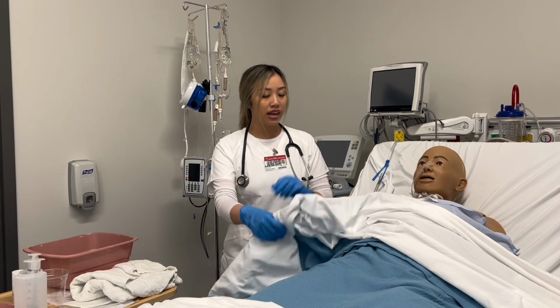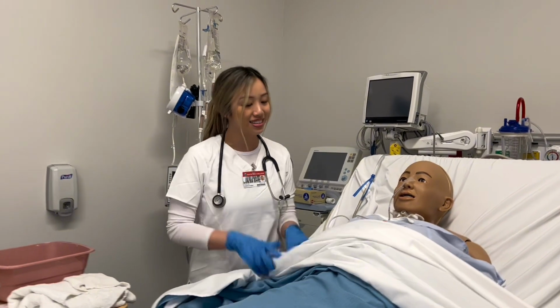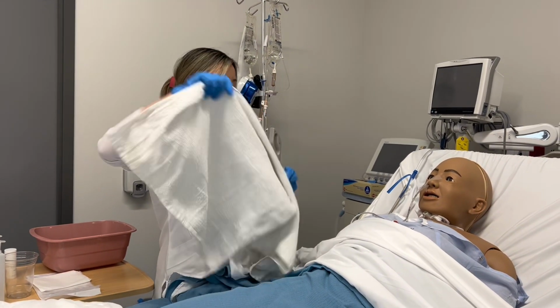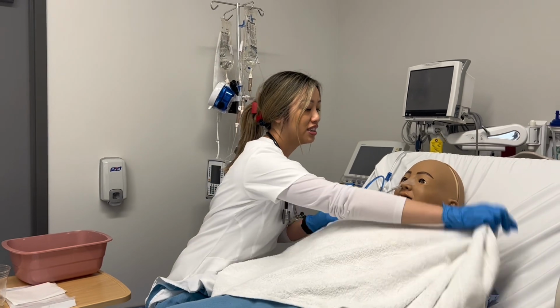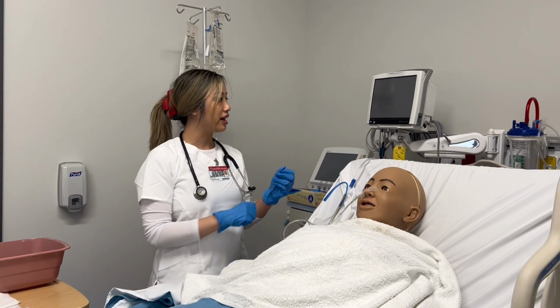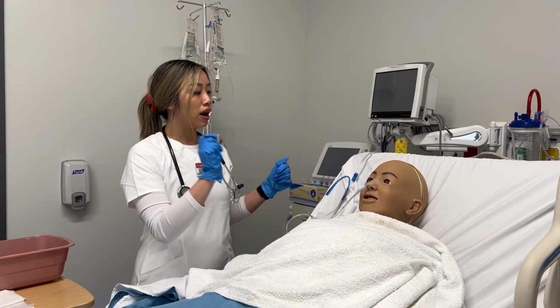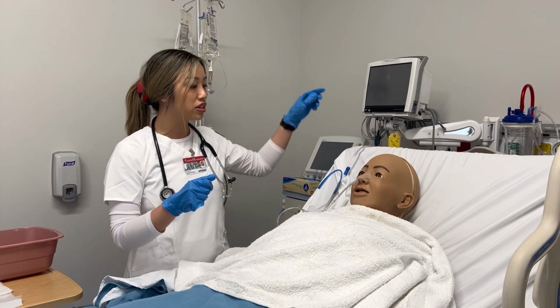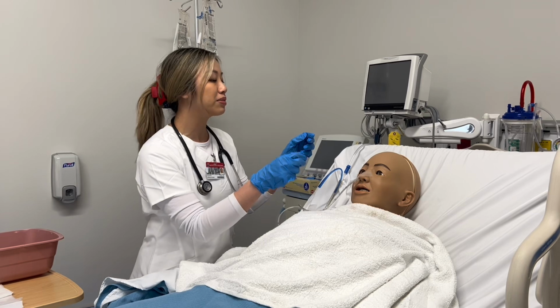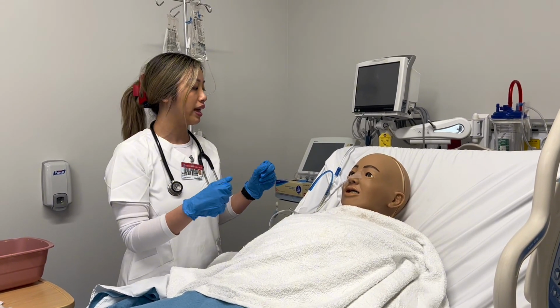So let me just identify my patient again. Mr. Smith, March 6, 1966. I'm going to go ahead and drape you. So I'm going to go ahead and drape my patient. Okay, so then at this time, I'll go ahead and explain everything. So I'm going to be taking the tube out. I'm going to switch off the suction. And then on my count, I'm going to tell you to take a deep breath and then hold it while I remove the tube, okay?